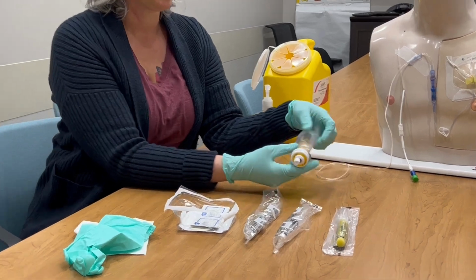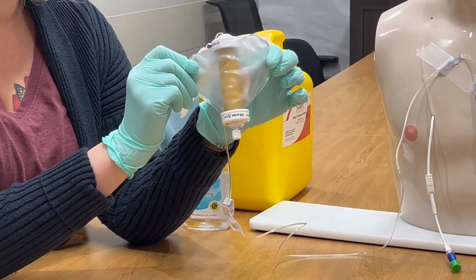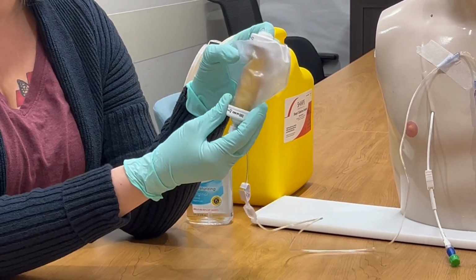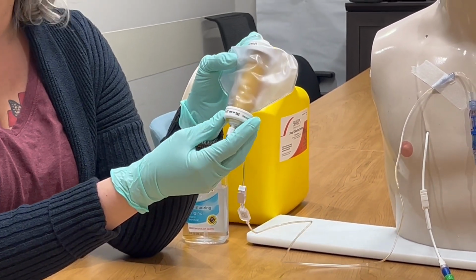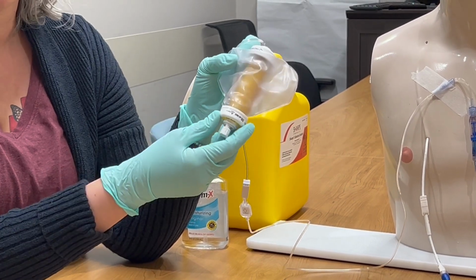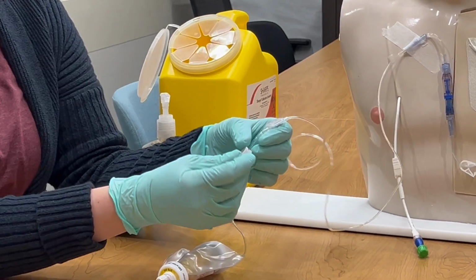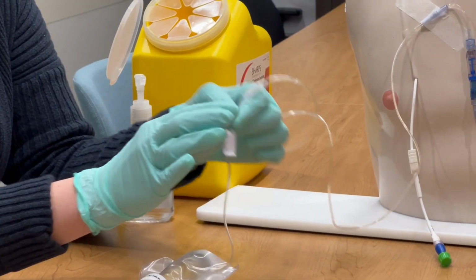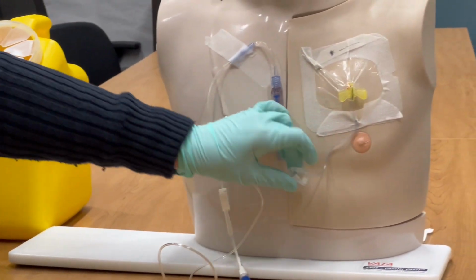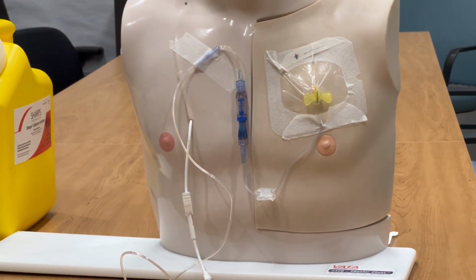Next, we're going to check our chemo and make sure that it infused all the way. This is what the device looks like when it's empty. So this is what it should look like before you disconnect it. And you also want to make sure that it's been connected for the right amount of hours. We can tell that it's empty, so we're ready to close our clamp on the medication tubing. And we're going to close the clamp on the port tubing. You just squeeze it to close it.